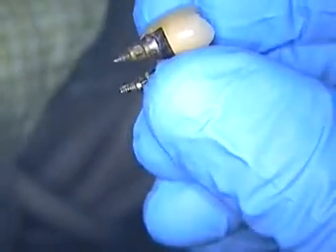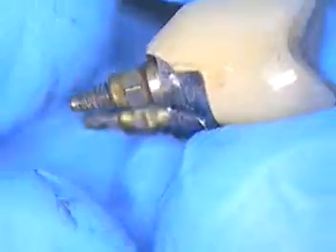Hello, this is Dr. Jerry Cuomo. We just retrieved the two-unit splint. We're able to back out the screws and we're now looking at internal hex, with lots of bio burden.